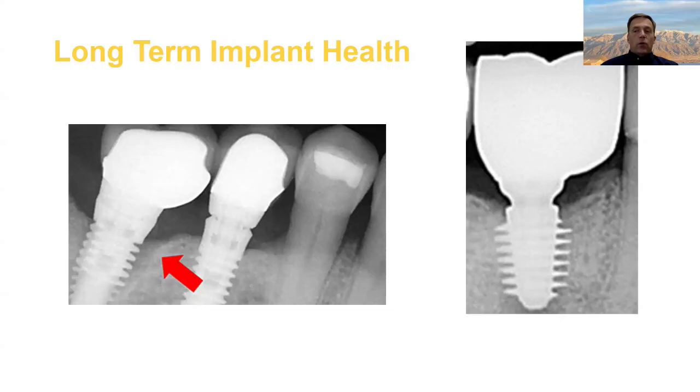There have been, as you know, a lot of improvements in implant materials and especially surface microtexture, something we've seen a lot of work on. But believe it or not, the biggest contributor to better crestal bone retention has been the switch to platform shifted implants. These days, most of the implants that you buy are going to be intrinsically platform shifted, but there are a few systems out there that still don't have that.